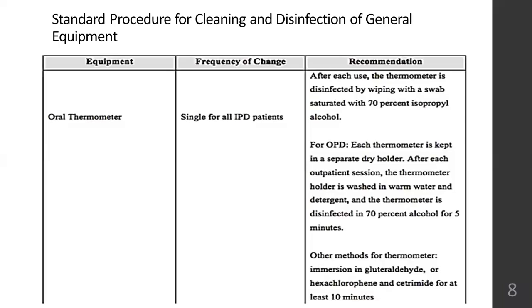Or what you can do is immerse the thermometer in 2% glutaraldehyde solution, or hexachlorophene solution, cetrimide solution. These solutions can be used for at least 10 minutes if the thermometer is kept in this solution. Wipe it and then use it on the patient. That is also fine.